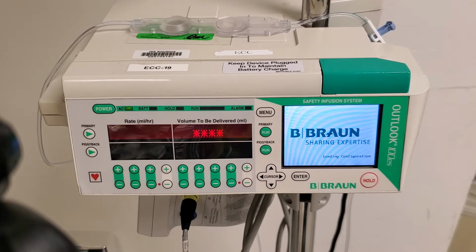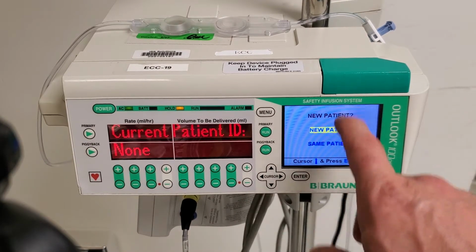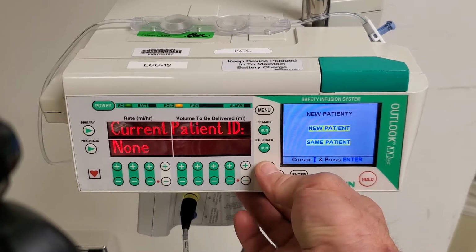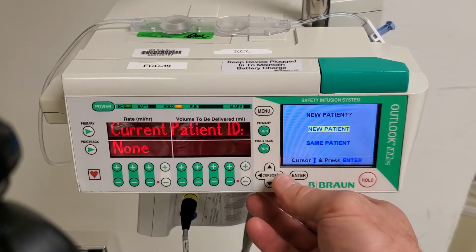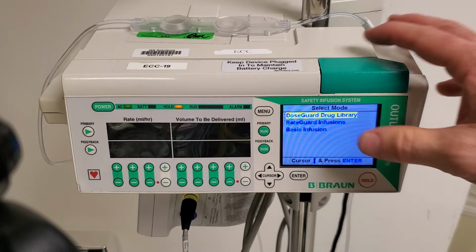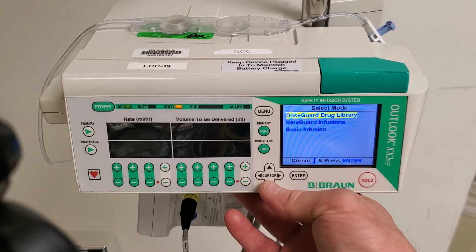Once the startup sequence is complete, we will select New Patient or Same Patient. Anytime we want to select features on the main screen, we use the cursor, arrows, and the Enter button. There are 3 options for drug infusion. There are 2 drug libraries that will have various drugs, heparin, nitroglycerin, propofol, etc. And then there's a basic infusion mode.